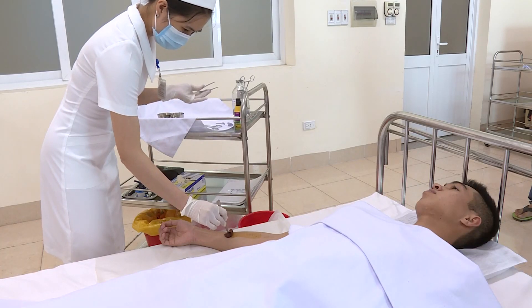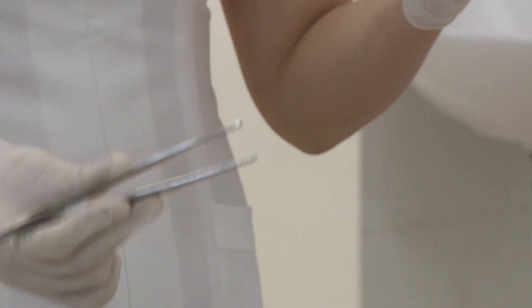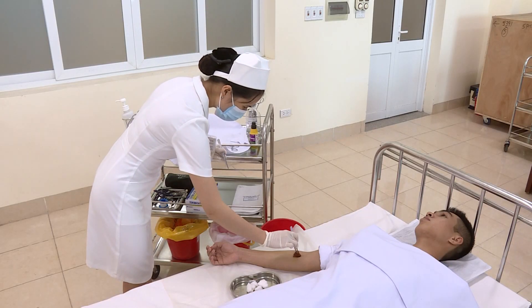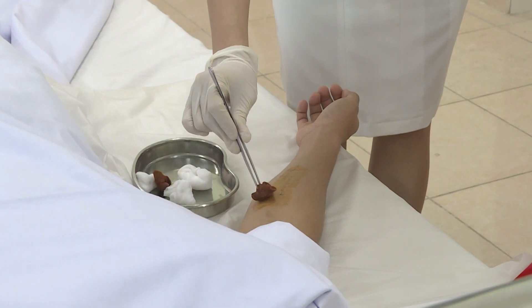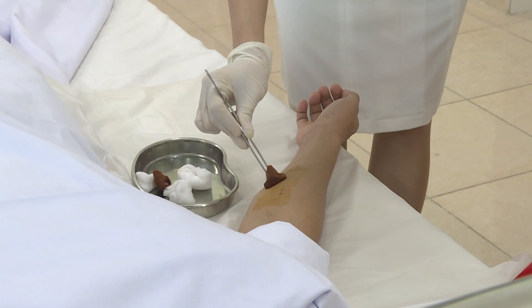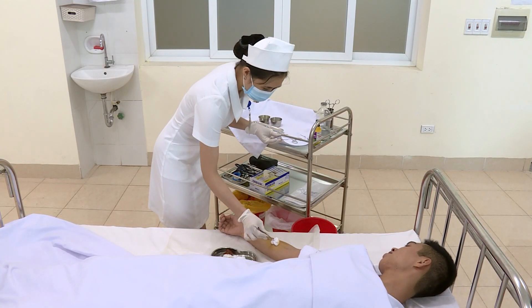Sát khuẩn vết thương bằng dung dịch betadine: tay không thuận cầm kẹp để gắp bông cầu trong bát inox có dung dịch betadine, chuyển sang tay bên thuận để sát khuẩn vết thương. Sát khuẩn từ trên xuống dưới, từ trong ra ngoài đến khi sạch. Thấm khô vết thương. Hỏi cảm giác của người bệnh.